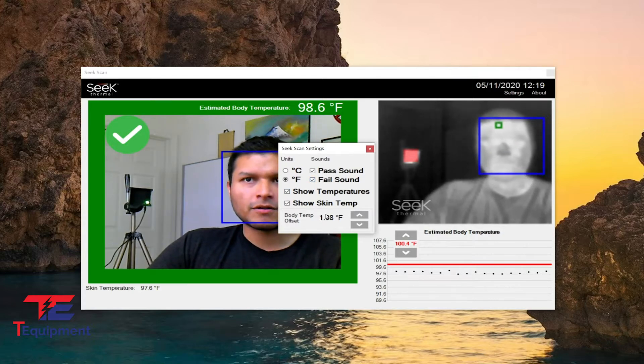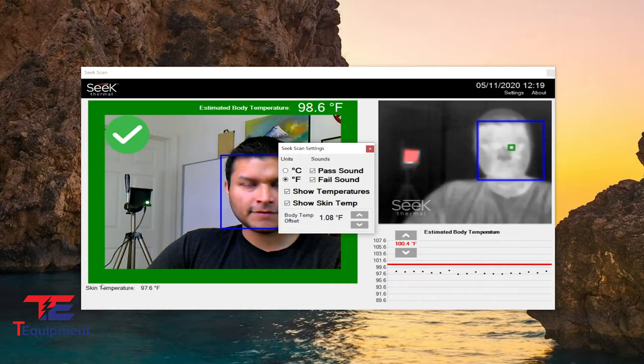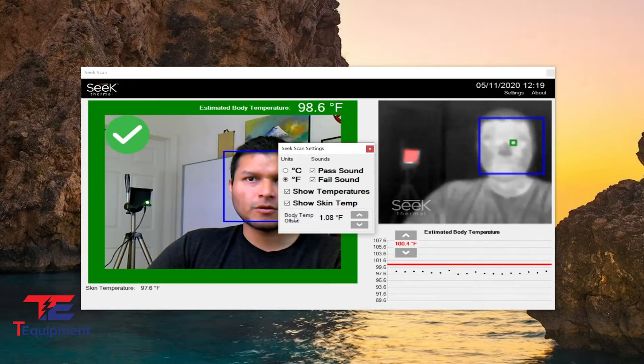You're going to notice that I like to have the show skin temp enabled, and this gives me the skin temperature at the bottom left. You will also notice that the body temp offset has been changed from the regular 2.16 degrees Fahrenheit to 1.08 degrees Fahrenheit.